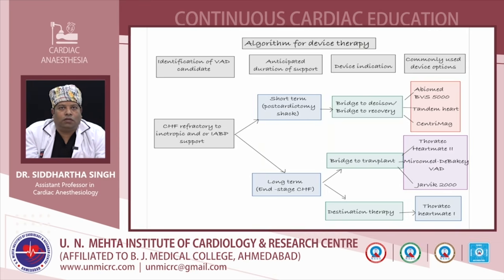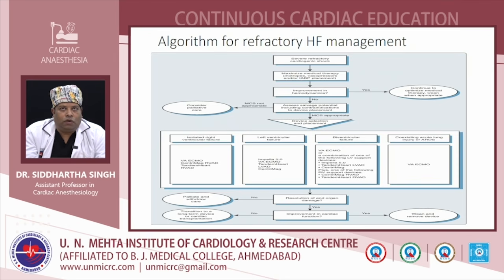If it's a post-cardiotomy shock and we are thinking of bridge to decision or bridge to recovery, in that case we choose a short-term LVAD like TandemHeart, CentriMag. For end-stage heart failure, which are candidates for transplant or destination therapy, we will go for a long-term LVAD like HeartMate 2, Jarvik 2000 or HeartMate 1.